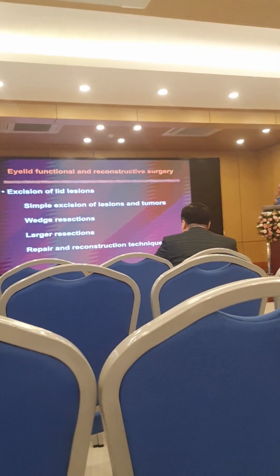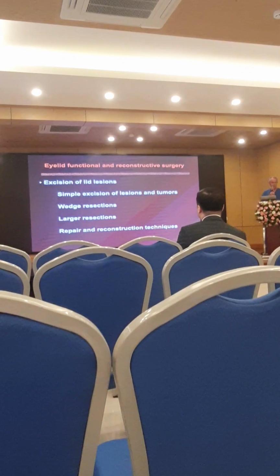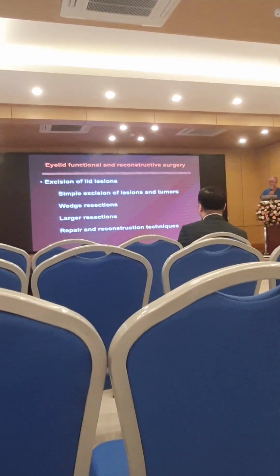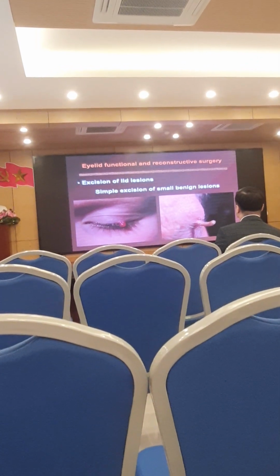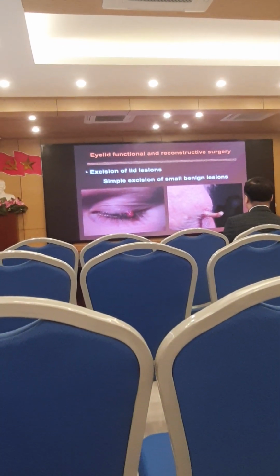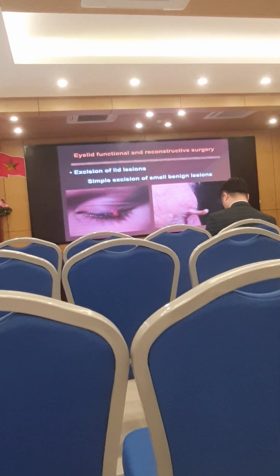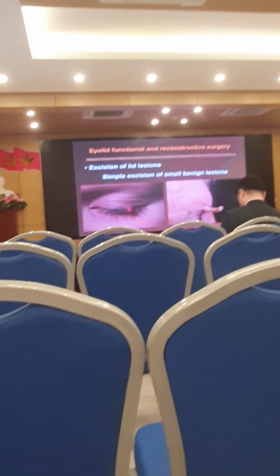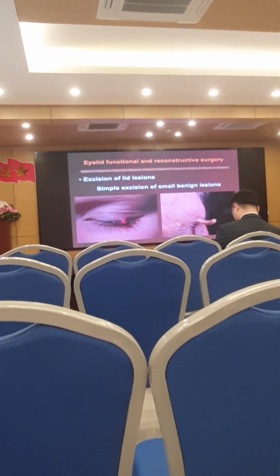Eyelid lesions, simple excisions, wedge resections, and more complex reconstructions for eyelid tumor and eyelid lesion excisions. We all see simple lesions in our office every day. Most of these can be excised within a few minutes. Local anesthesia, forceps, scissors, we excise the lesion. If it looks suspicious, I always send it to pathology.